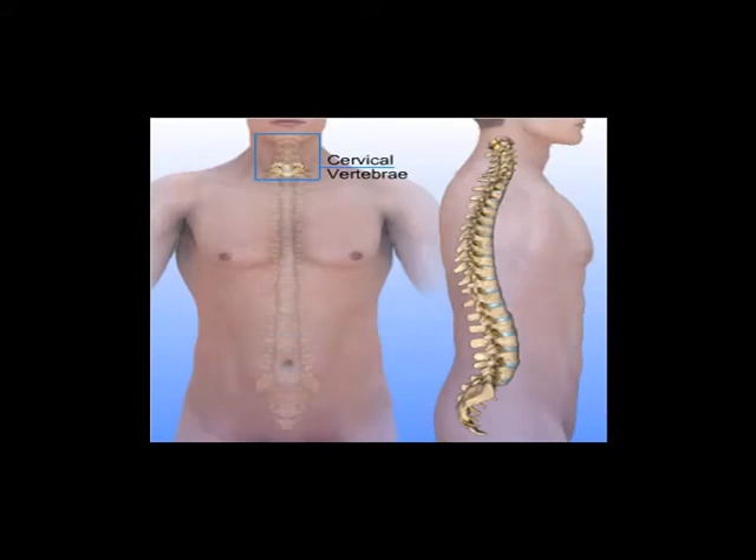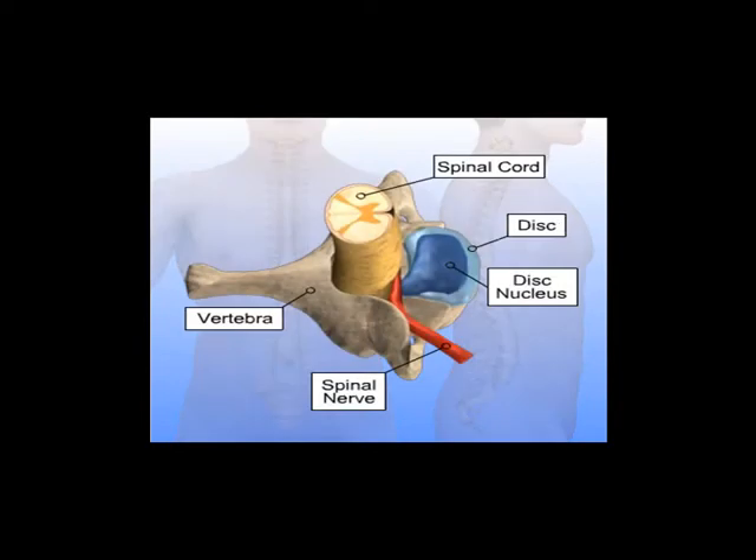Anterior cervical discectomy procedures are usually performed to remove pressure on nerves from disc herniations. A disc herniates when the outer portion of the disc ruptures and some of the softer disc nucleus material squeezes out. The herniated disc pushes against the spinal cord or spinal nerves and tends to cause pain in the neck or arms. Removing the ruptured disc alleviates pressure on the nerves or spinal cord, which usually relieves the pain.